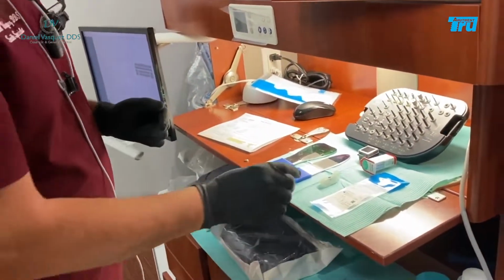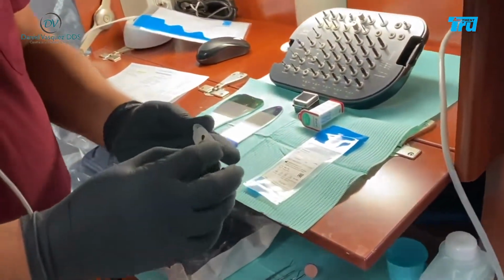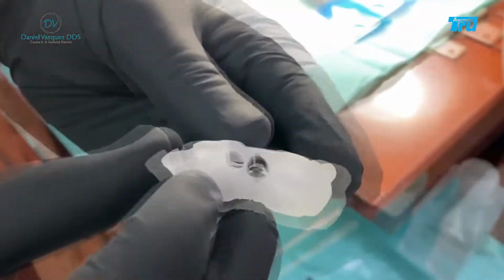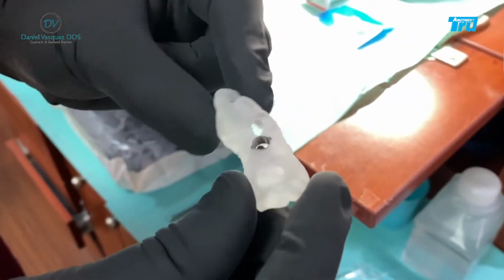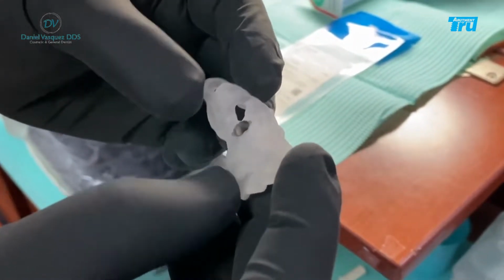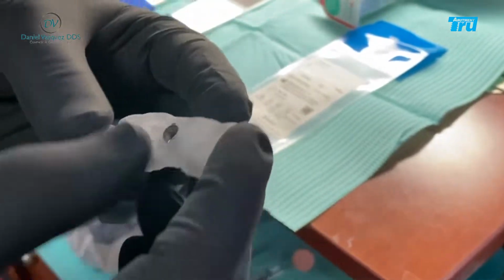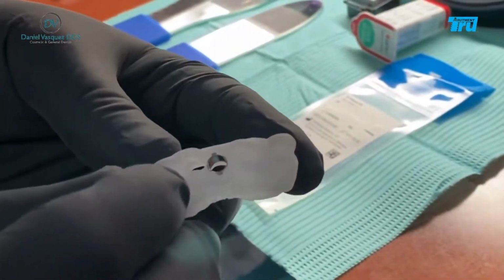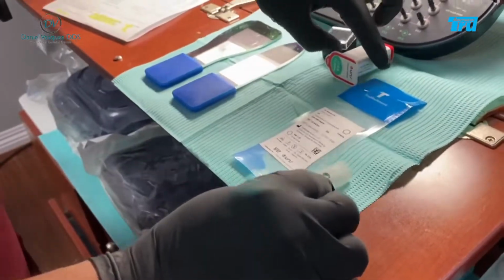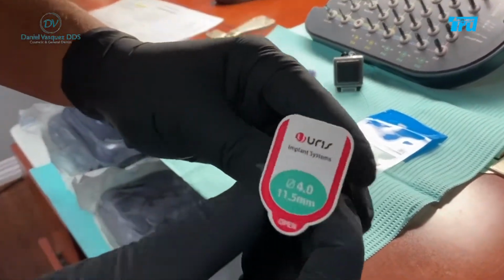But before we do anything, let me show you the surgical guide that we're going to be using today. This is made by URIS. It's been designed on 3Shape and has been printed, I believe, with Carbon. A very precise surgical guide. There are 2 wings. This is the implant system, the implant that we're going to be using.